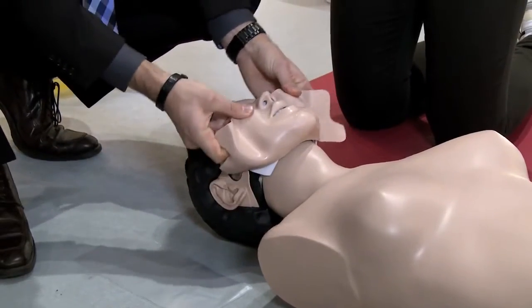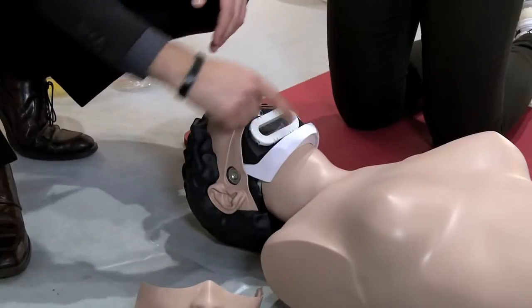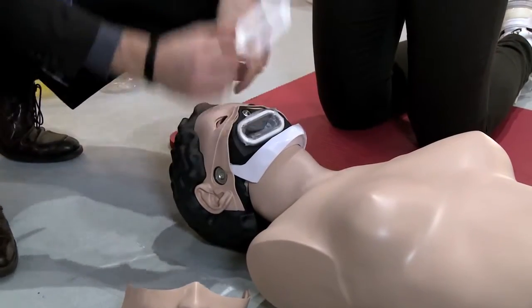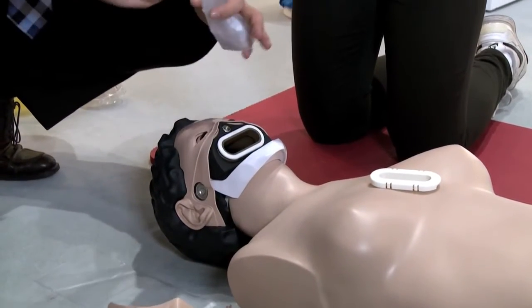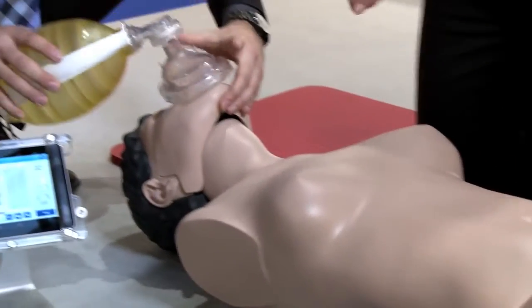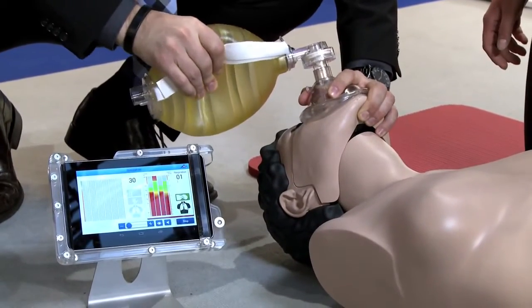The disposable throat bag is inserted into the mouth cavity and fastened with the bag clip. The breath of the student will remain inside the throat bag and will not contaminate any other part of the simulator. The two-chamber system ensures a realistic chest rise during ventilation.